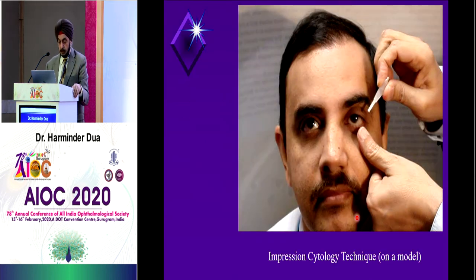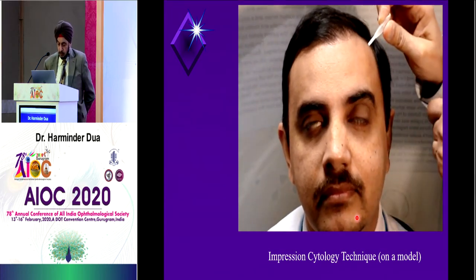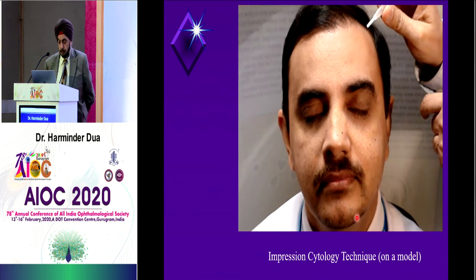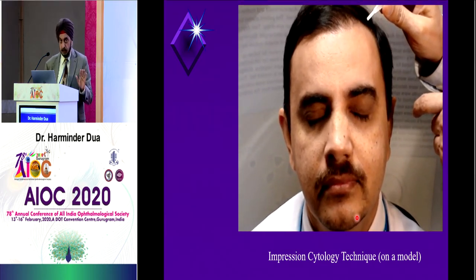So here is one of my fellows who came from Karachi. He became a model for impression cytology. So a drop of topical anesthesia to numb the surface, then let it dry. Remember the key word is dry.